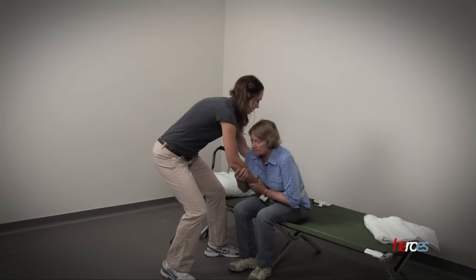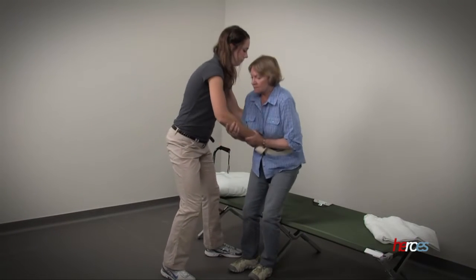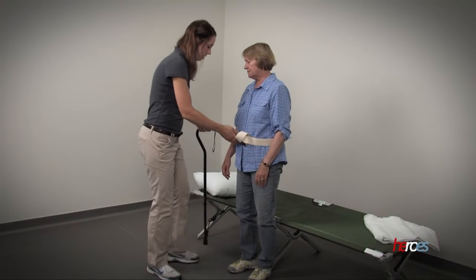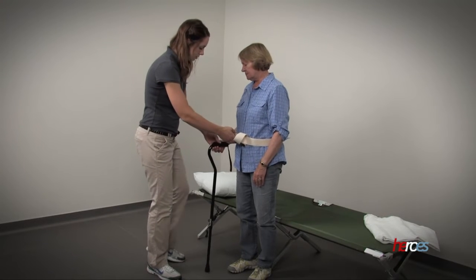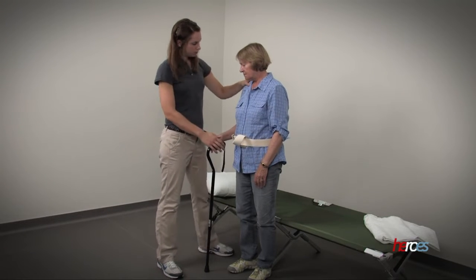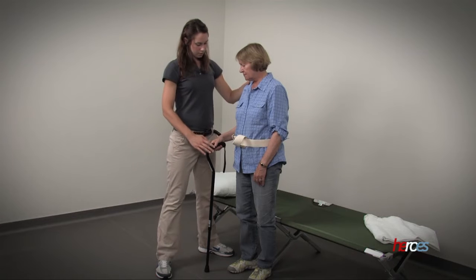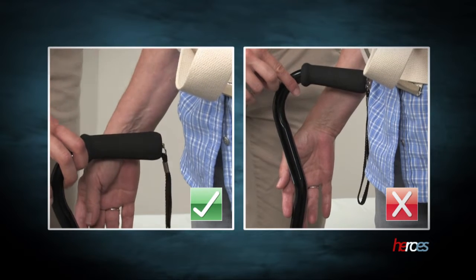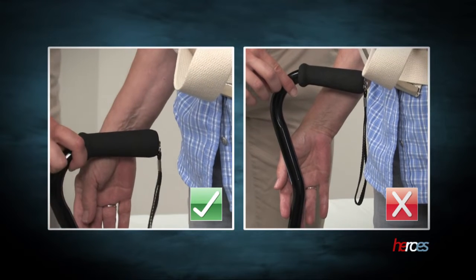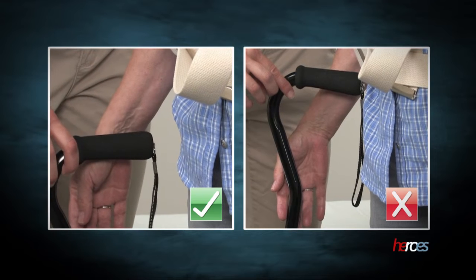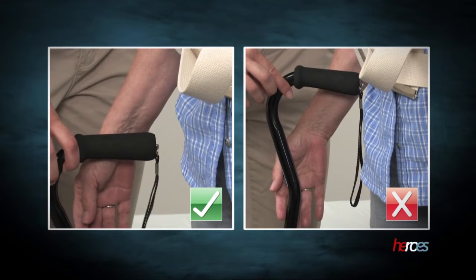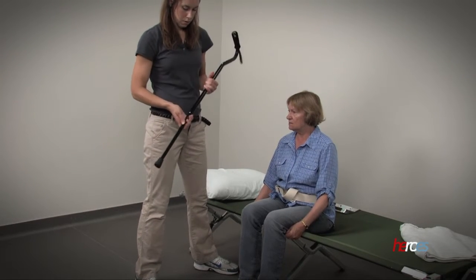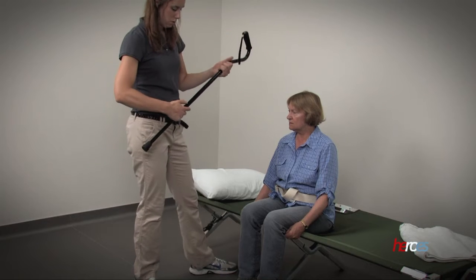Fitting a cane is much like fitting a walker. Make sure that the individual is standing up straight with their shoulders relaxed. Ask the individual which hand they normally hold the cane in. With their hand at their side, the individual's wrist crease should fall at the level of the handle. As with the walker, the height can be adjusted using the push pins on the leg.